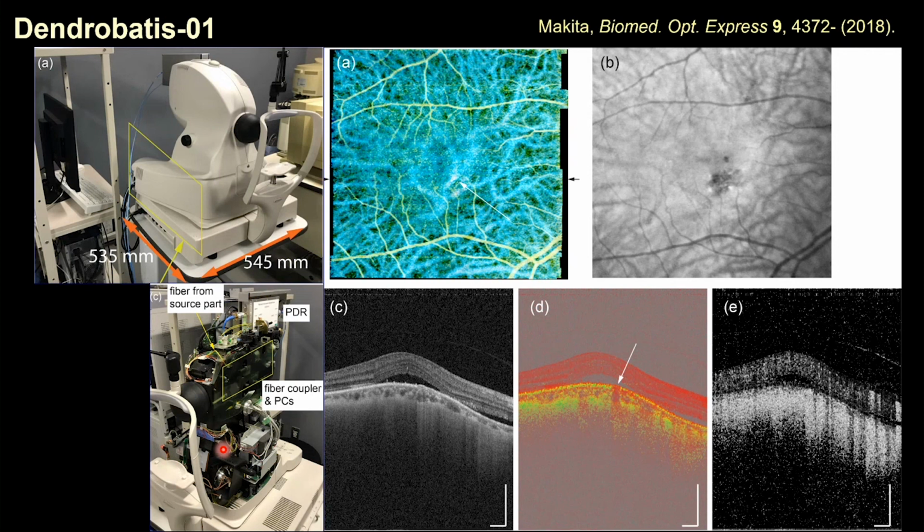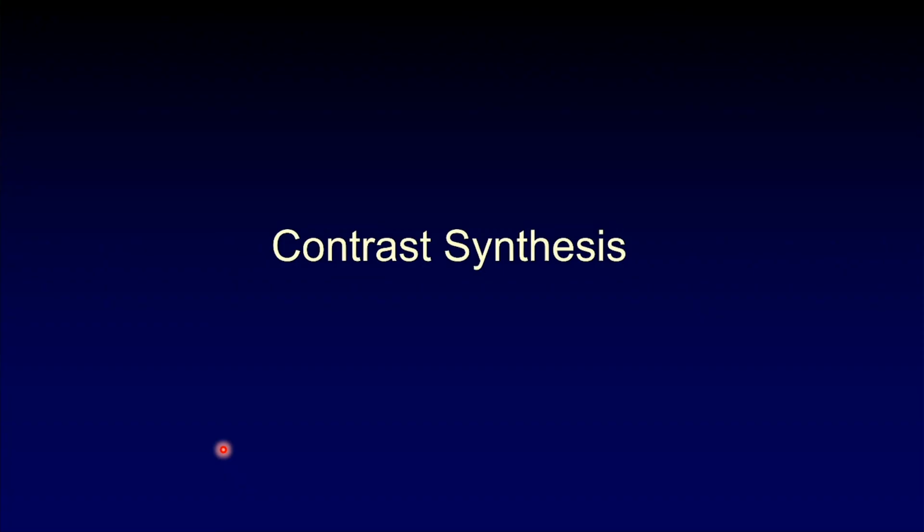Okay. By using it, we started to do a higher dimensional contrast generation. Okay, so now there is a Jones matrix OCT conception, and we can have the primary contrast. And then we started to combine these primary contrasts to derive a tissue-specific contrast.